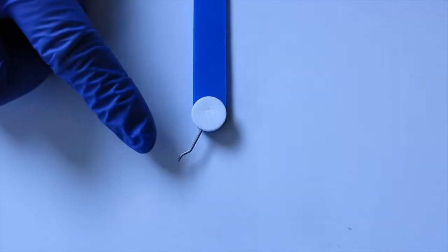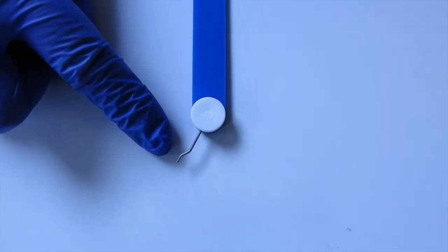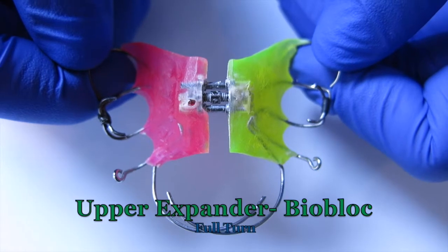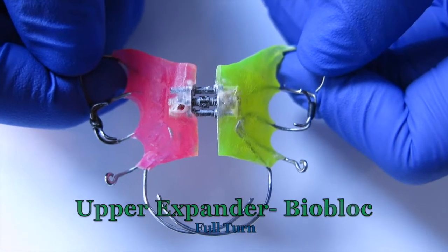This is your key and make sure that this bend is inserted all the way into the hole for turning. Now I'm going to teach you how to turn your expanders. First, I will teach you a full turn.